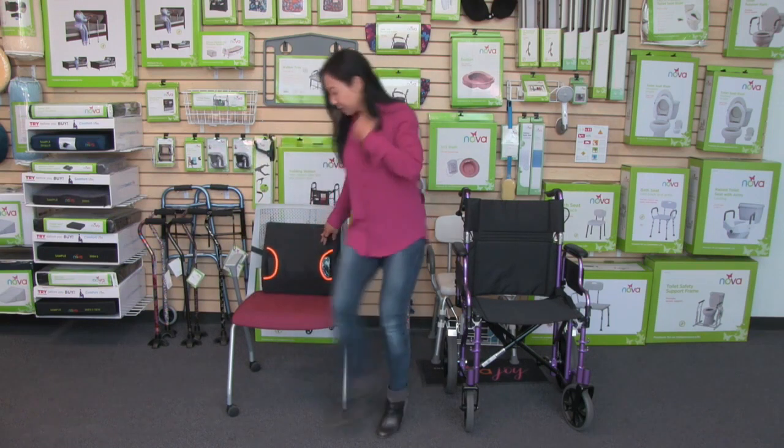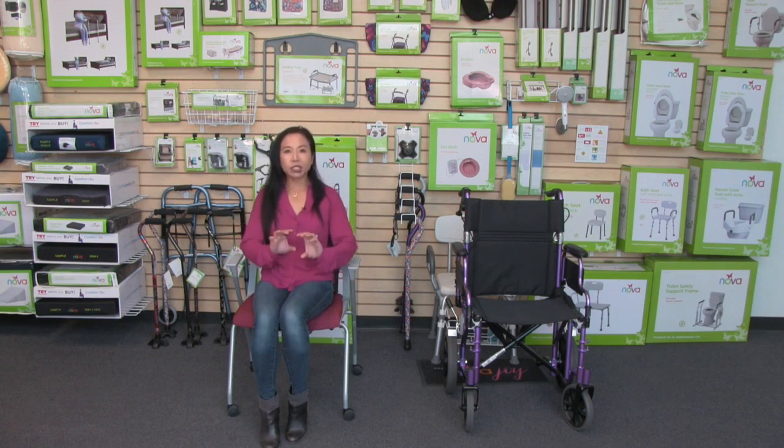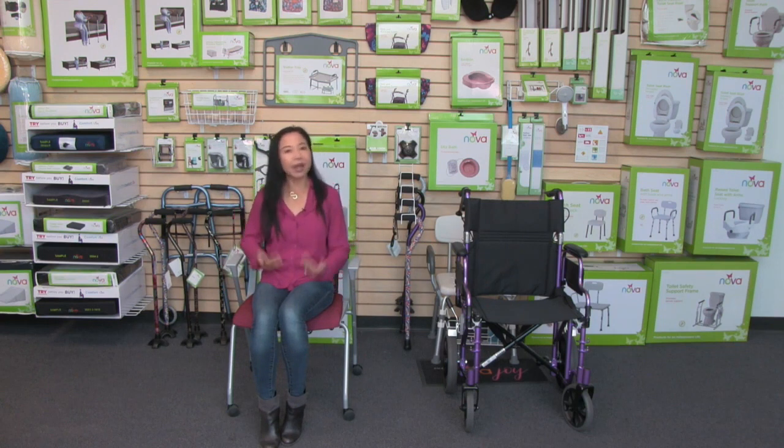Now I'm going to sit down. I can just feel that heat right on my lower back. That extra lumbar support just really nestles it in there, so I can really feel that temperature and it's just so soothing. With this lumbar cushion as well, while I'm sitting comfortably, I can also get some therapy on my lower back.